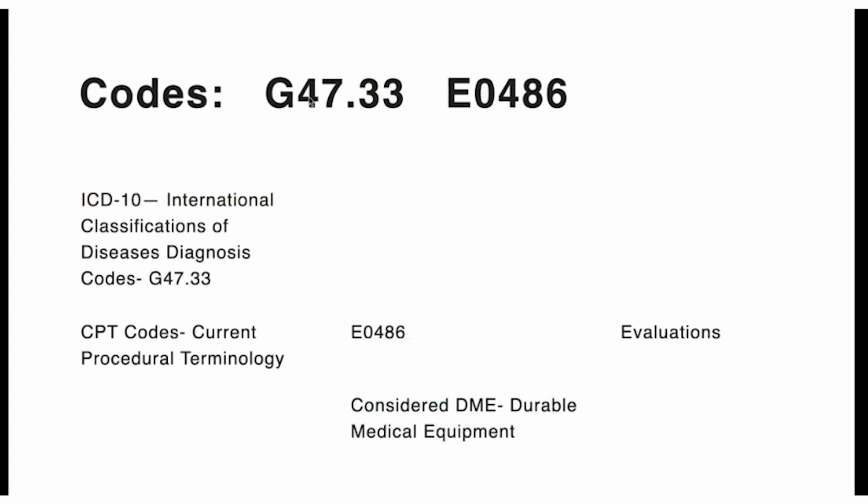We do a delivery, a 1 to 2 week follow-up, depending on how many adjustments we made or how confused they seem, and then a 4-week follow-up. And then we do a follow-up sleep test if they're in that moderate to severe category, to make sure that the appliance is working, and put them on an annual recare after that, or see them in their dental appointment, regular periodic evaluations. But the only diagnosis code that works for an oral appliance is G47.33, and that is adult or pediatric obstructive sleep apnea.